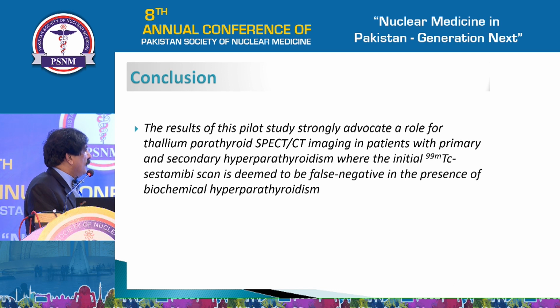So the results of this pilot study strongly advocate a role for thallium parathyroid SPECT CT imaging in patients with primary and secondary hyperparathyroidism when the initial technetium MIBI scan is deemed to be false negative in the presence of biochemical hyperparathyroidism, and I'll stop it here.